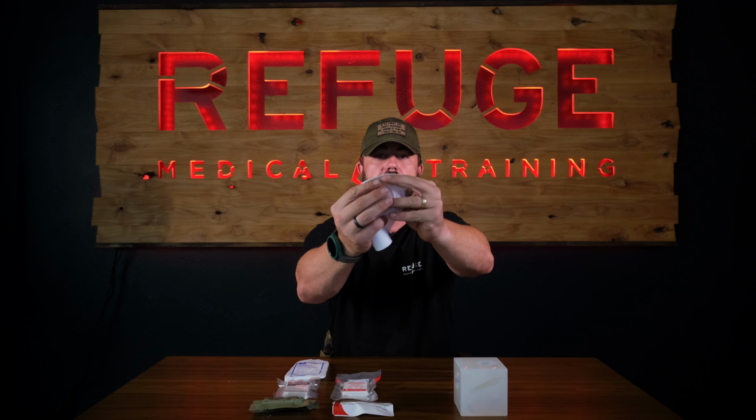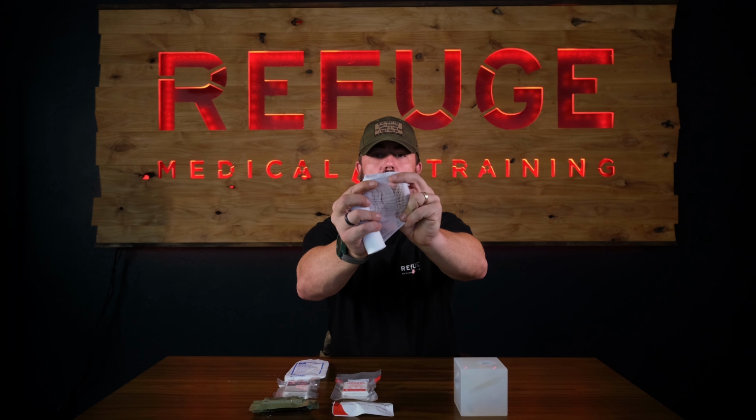So this is typically going to be a little bit thinner, right, than some of your compressed gauzes. In fact, shouldn't have thrown that package away. Gauze uses the same type of rating typically as toilet paper. So you can determine the thickness by the ply. So this is two ply, right? So there are two layers to this and it's woven together. You can probably see as I stretch it how it comes apart. It's woven, right? Woven gauze.